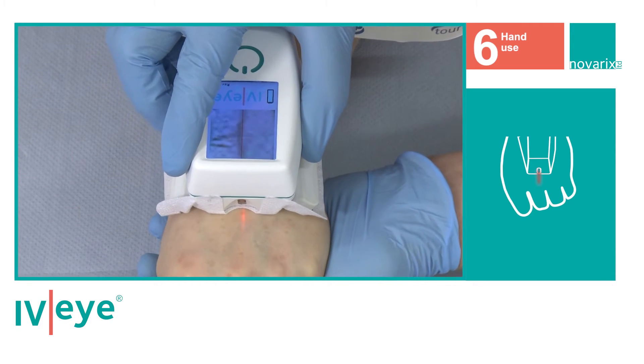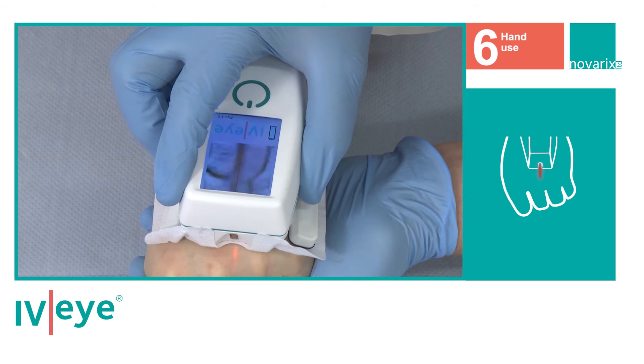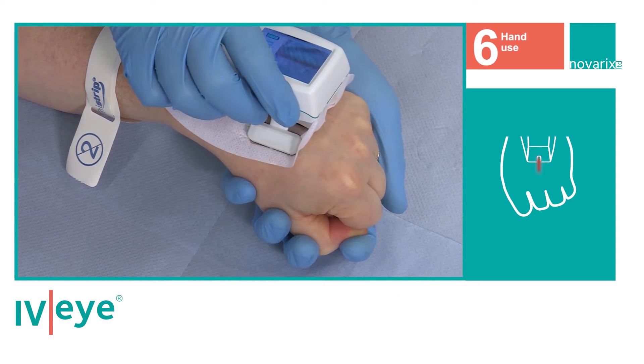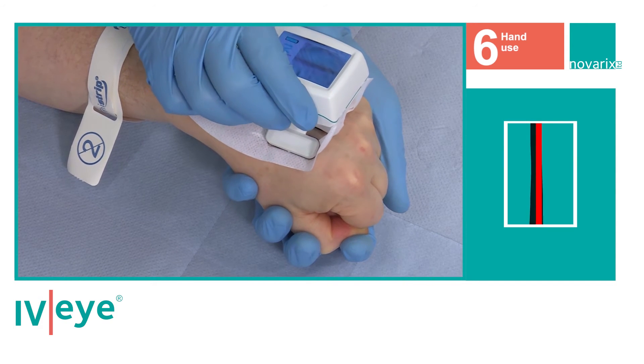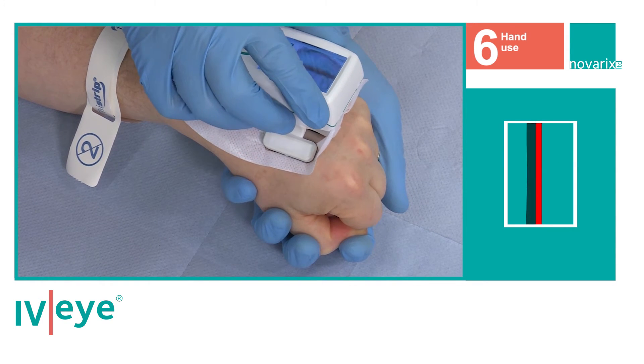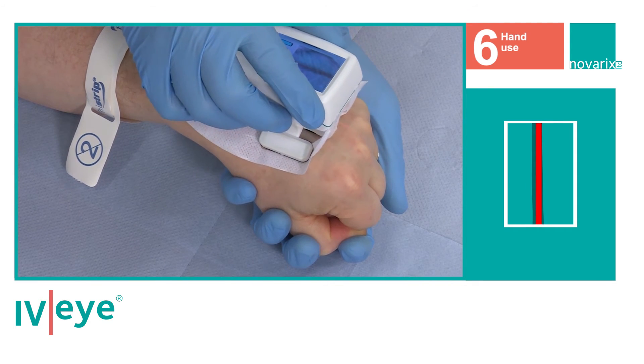Slowly move the IVI across the back of the hand until a suitable vein is identified for cannulation. Once a vein has been identified, track up and down the vein until a straight length of vessel can be aligned with the red centre line on the display.